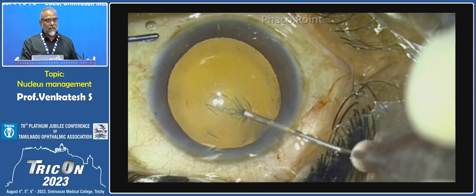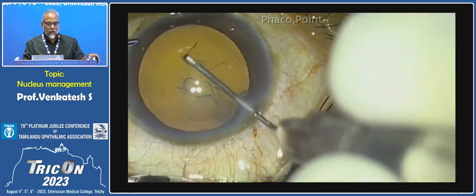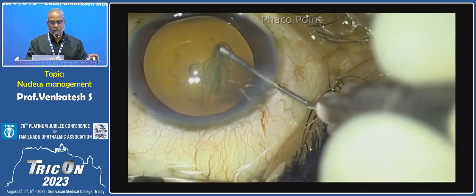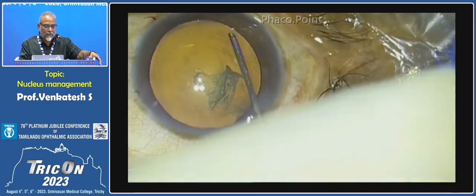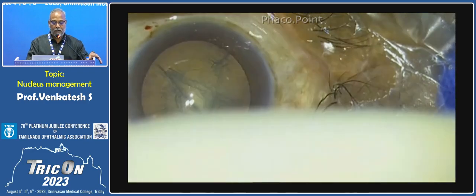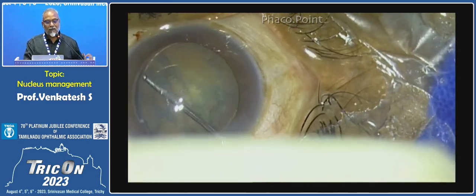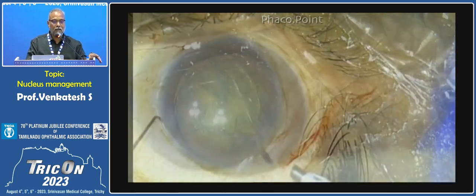So I have devised a modification of the hydroprolapse technique, which I call endonucleus delineation and hydrolift. In this case, as you can see, I'm performing just my routine 5 mm capsular rexis, though it's slightly eccentric. I create a cortical cleavage hydrodissection, and I follow it up with a hydrodelineation. Remember, you don't have to prolapse the entire lens. You have to just take out the nucleus. The nucleus will easily come out of a 5 mm capsular rexis.